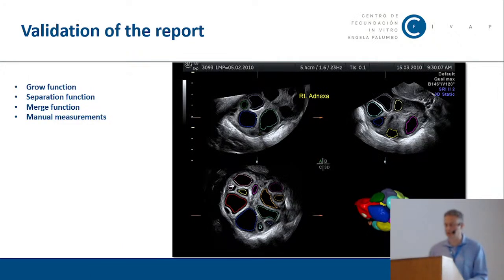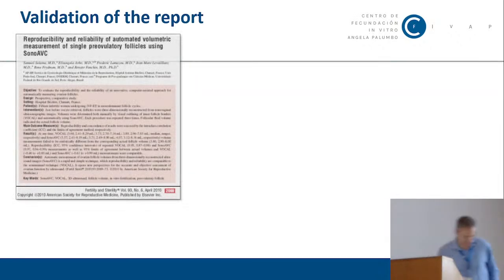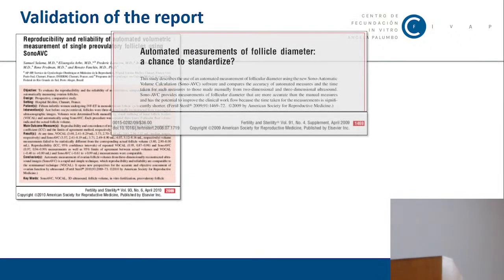The system has this limitation and does not always produce quality images and well-defined follicles as this. It is important to validate the data obtained in the SonoAVC report. The tool for the optimization of the result will be discussed by Dr. Rodriguez in the next presentation. Sorry.